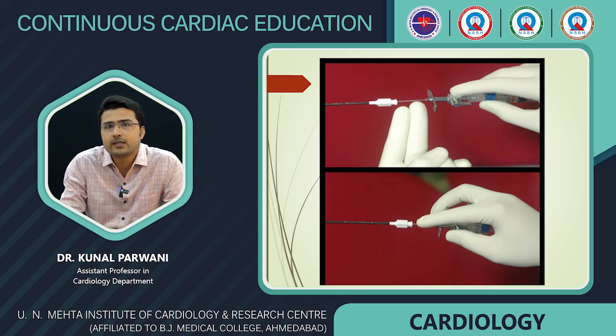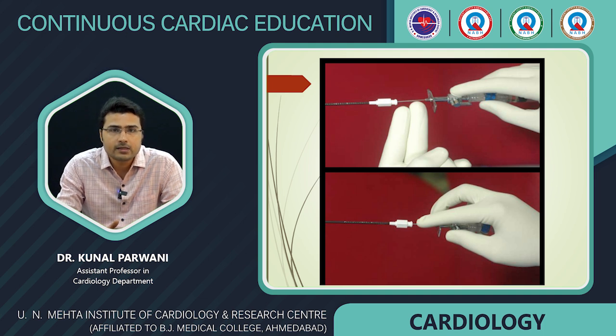The operator should fix his right index finger between the catheter hub and the indicator of the Brockenbrough needle to prevent the needle from moving forward and protruding from the catheter tip. Usually the direction indicator of the needle is kept between 4 and 7 o'clock position. The thumb and the middle finger should maintain the direction of the needle so that its direction and position is not changed. Once the needle is in place, the saline is disconnected and the 3-way stopcock is connected to diluted contrast, that is 1:4 dilution, and a few ml of contrast is injected through the needle to confirm the flow.